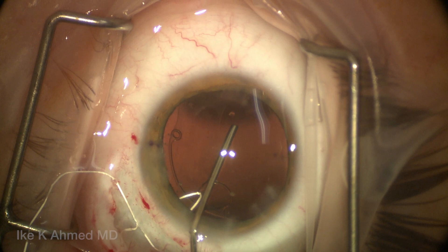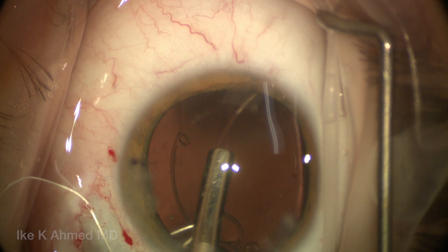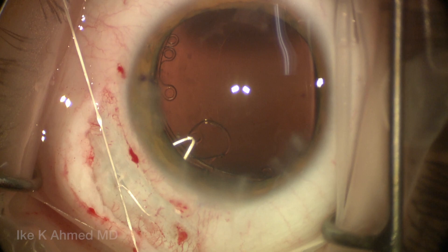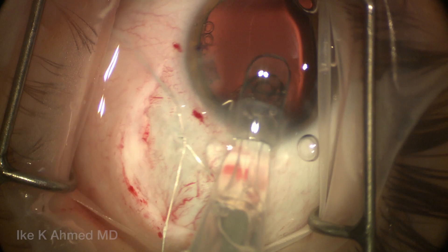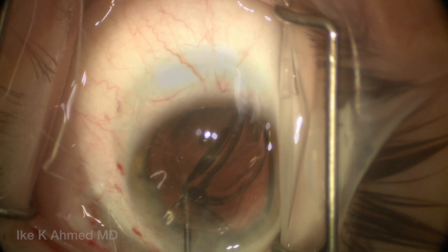We're ratcheting up the tension in the capsular bag. We still have not fully tightened things up, and a CTR is now injected through an injector into the capsular bag for circumferential tension, to expand the capsular bag and allow it to be positioned centrally. It can sometimes be difficult passing the CTR around the CTS — ensure there's enough OVD in the capsular bag prior to injection; some twisting and turning can help get around the CTS. We enlarge the incision slightly to over 3 millimeters to allow in-the-bag placement of a single-piece acrylic lens — in this case a toric — as this patient had two and a half diopters of cylinder. The IOL is injected safely into the capsular bag with both the leading and trailing haptics in the bag.